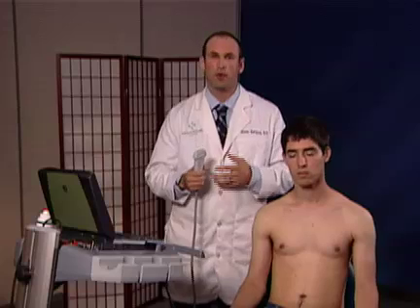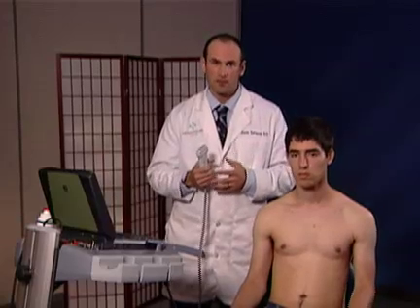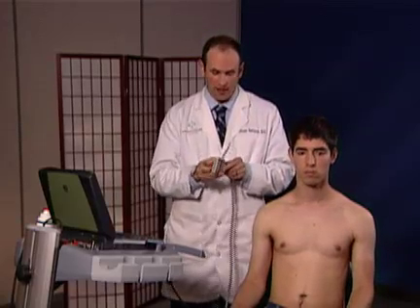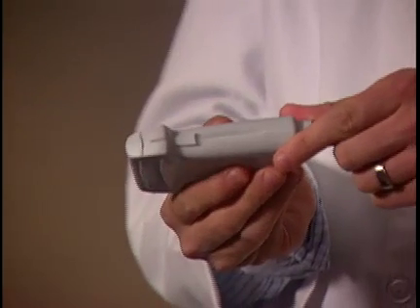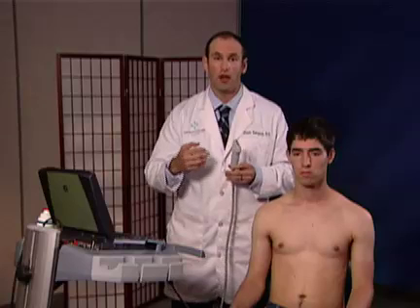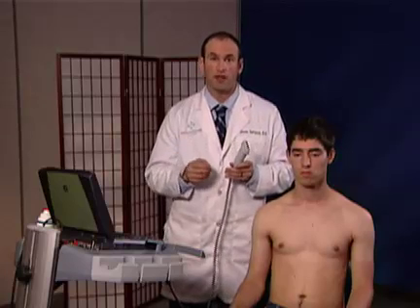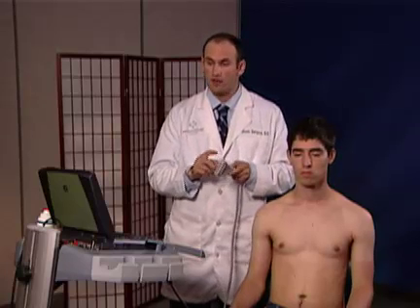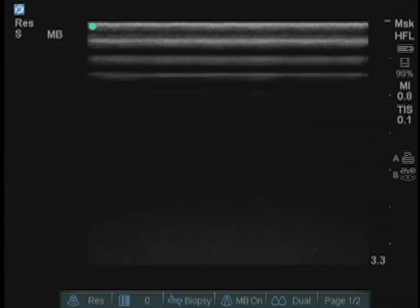In examining the shoulder, there are some important principles to follow. First of all, when holding the transducer, it's easiest to have the notch of the transducer always facing upwards or cephalad on the patient. That will always be your lighthouse, so to speak, of exactly where you are. I always keep the notch upward as well as looking at the upper left-hand corner of the screen to make sure I know exactly where I am.